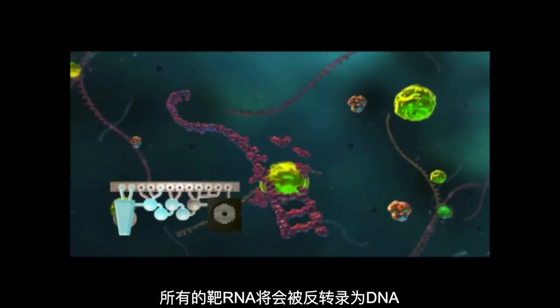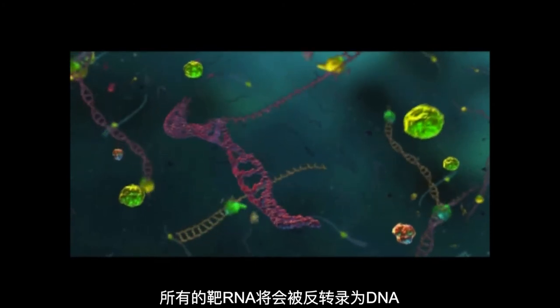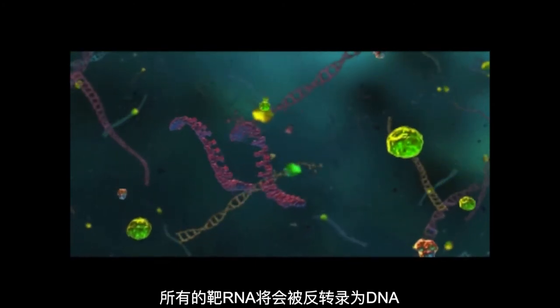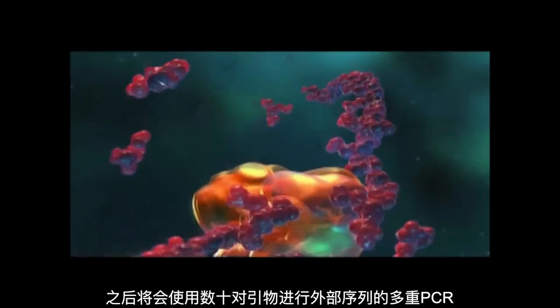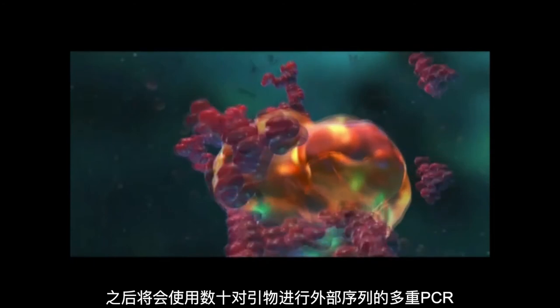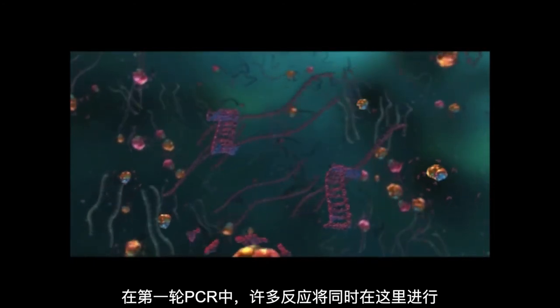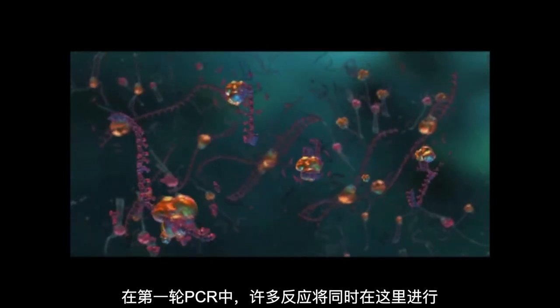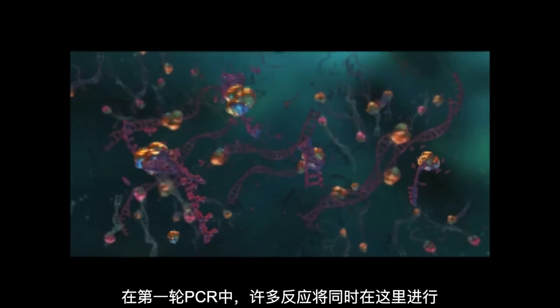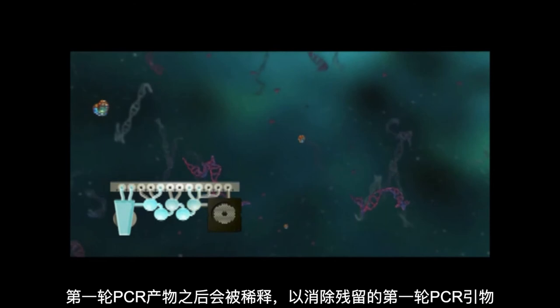A reverse transcription step is performed to convert any target RNA into DNA. This is followed by a high order multiplex PCR involving dozens of primer pairs. During this first stage PCR, many reactions simultaneously occur in this single large volume reaction. The products from the first stage PCR are then diluted to limit any remaining first stage PCR primers.